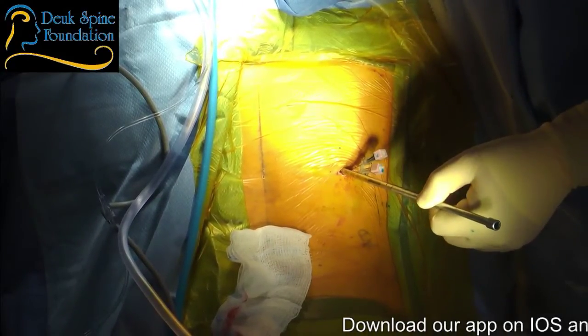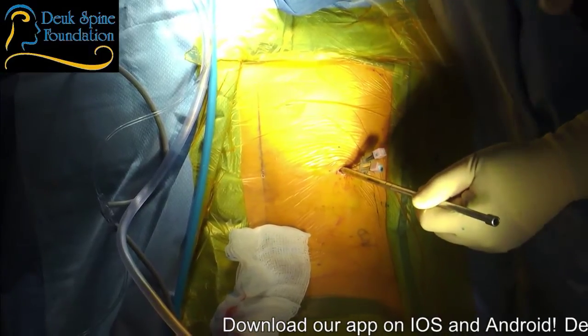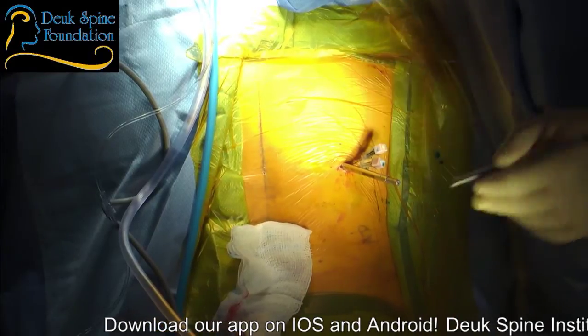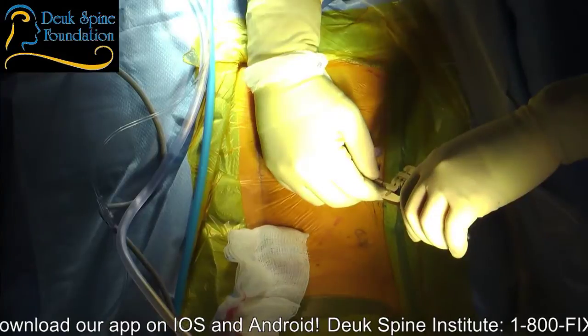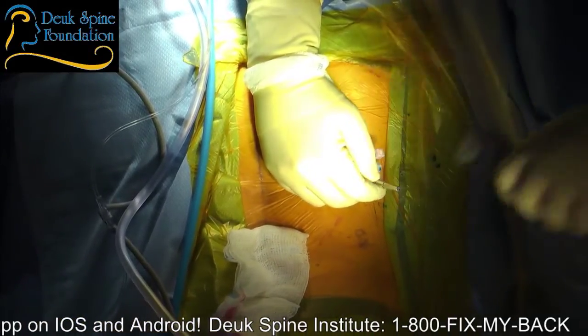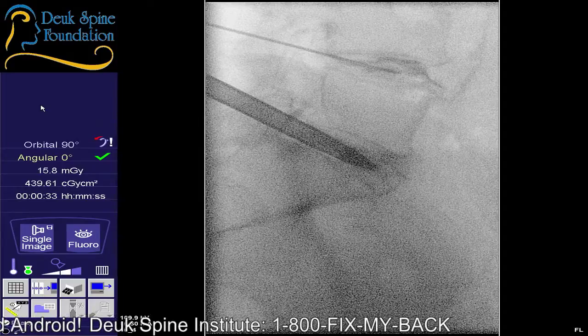In 14 years of doing 1,000 of these surgeries, 0 complications to date. Obviously, that's because I have great anesthesia. And as I was doing that, I want you to note that the dilator moved in a little bit, so we're going to back it out. You certainly don't want to put the dilator through the anterior annulus.